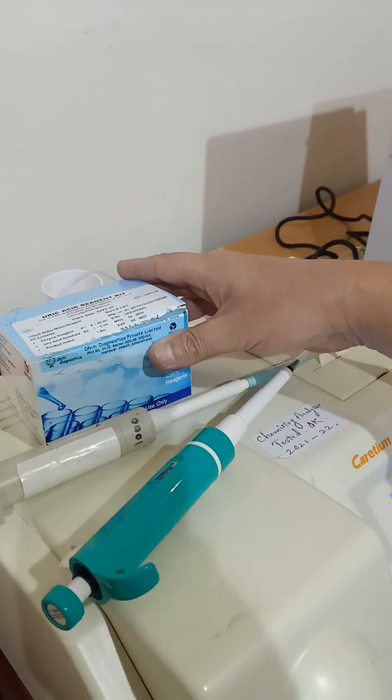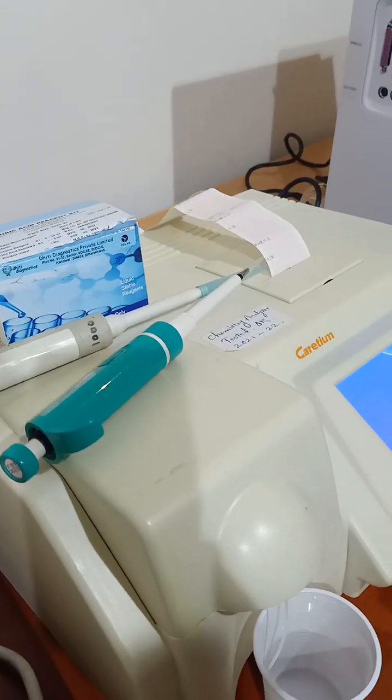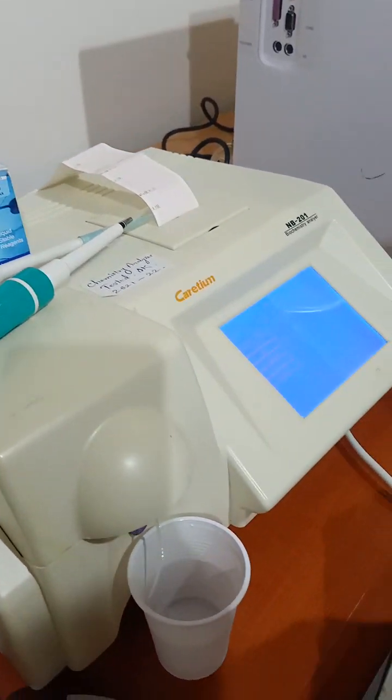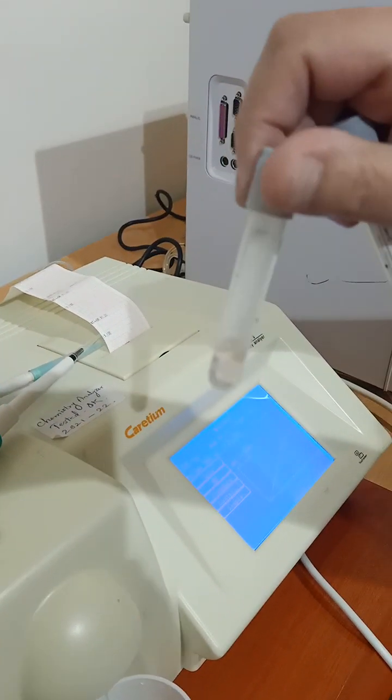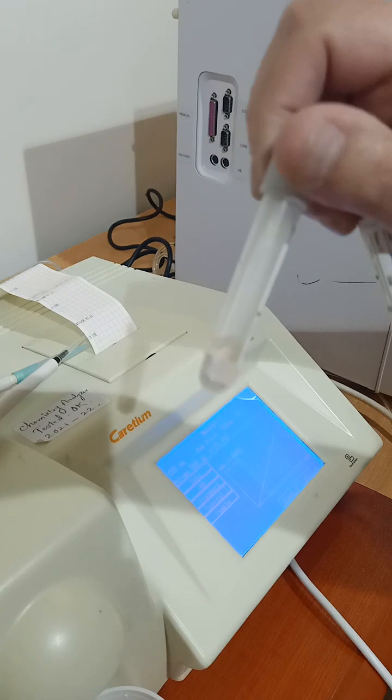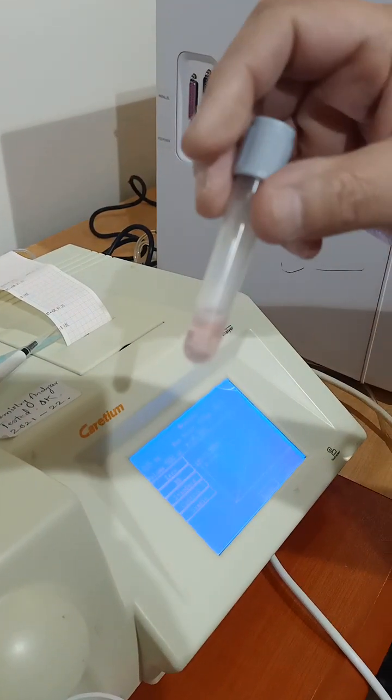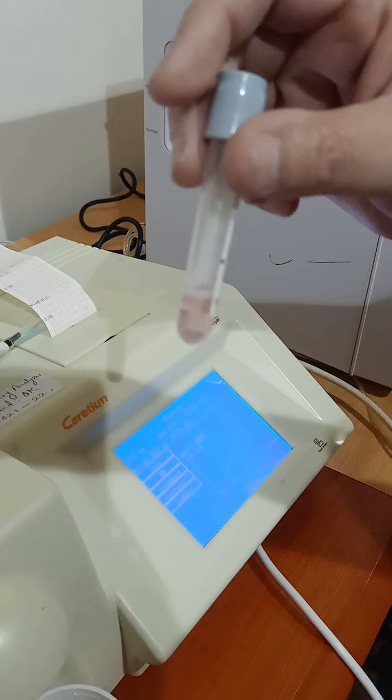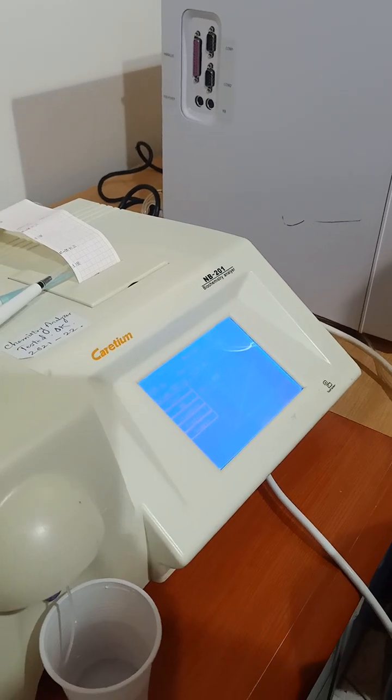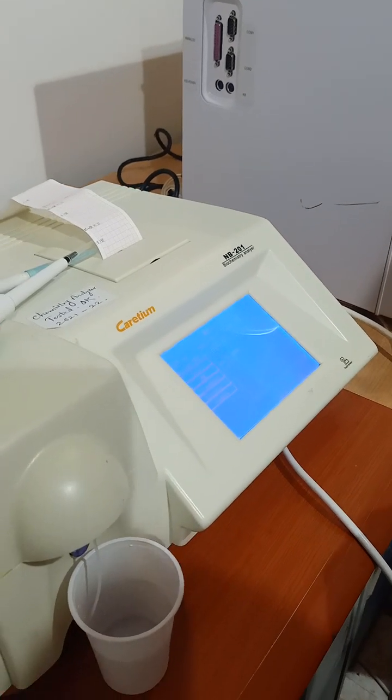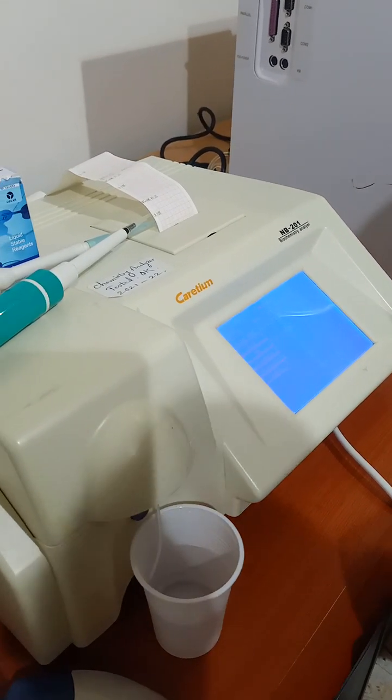First, we take one ml from the blank. This is the blank, one milliliter. And one milliliter for another tube. This is the standard. We take our sample. If it's sample or standard, 25 microliter.